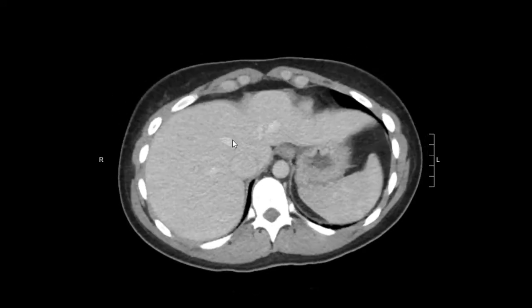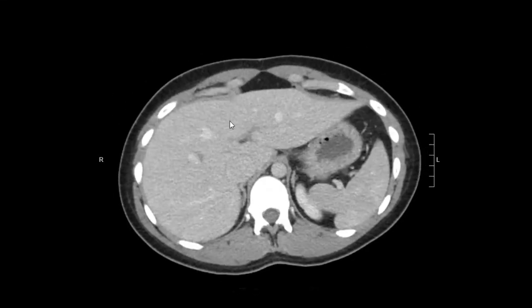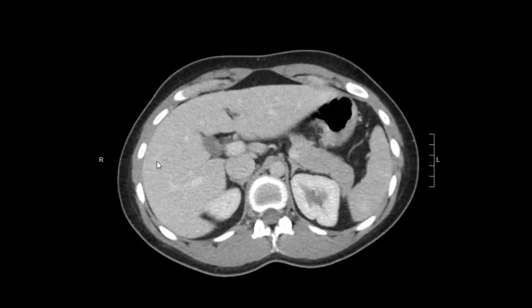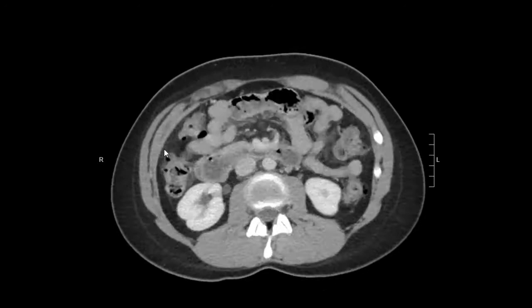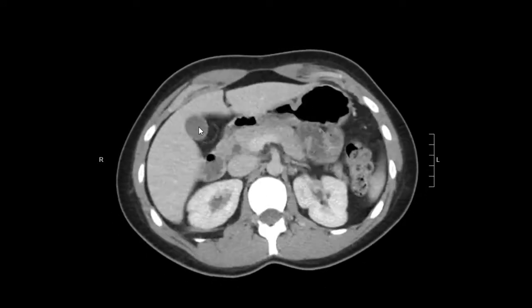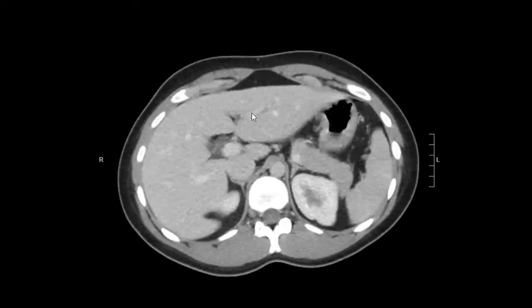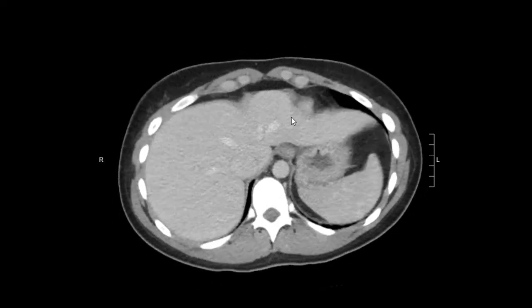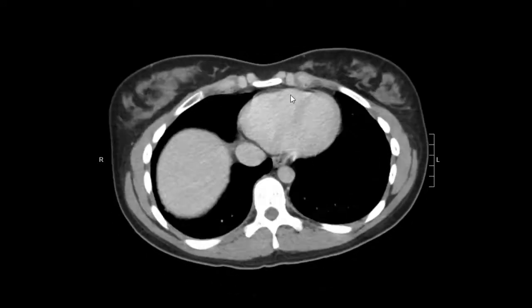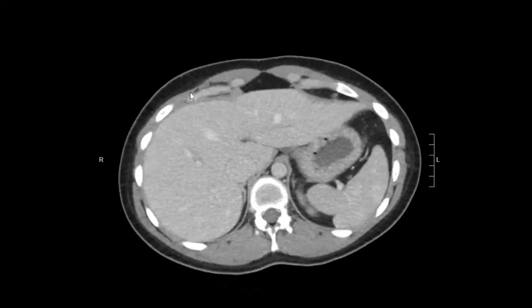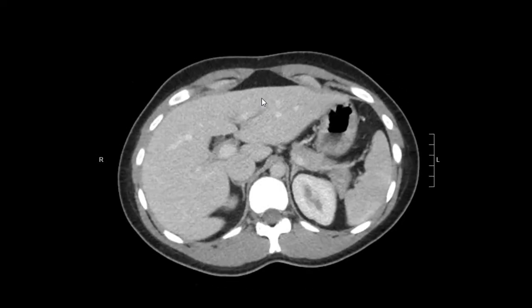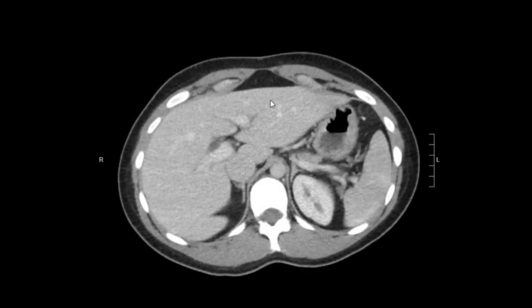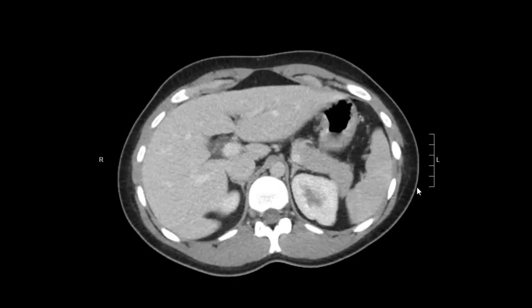First one on the list is the liver. I'm going to evaluate the right hepatic lobe and then the left hepatic lobe. The liver is normal in contour, normal in size, normal in density — so it's normal.